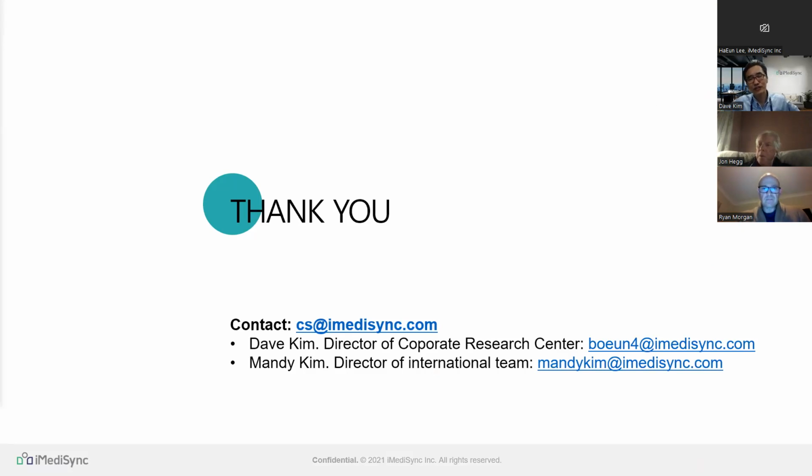If you can share your cases, we can discuss together on the meeting, or before the meeting, or we can use this international user group meeting. I'd like to invite another expert user, iSyncBrain wave user, in this meeting, and we can discuss together from now on, I think.